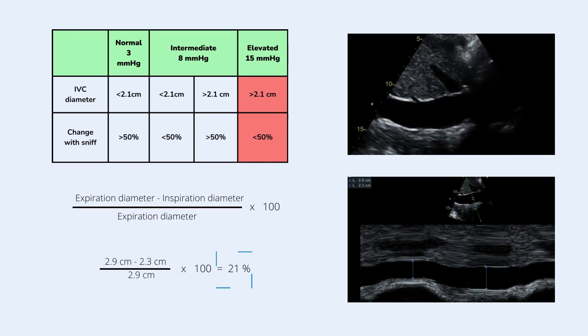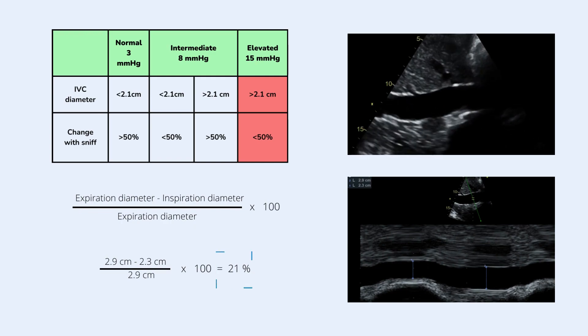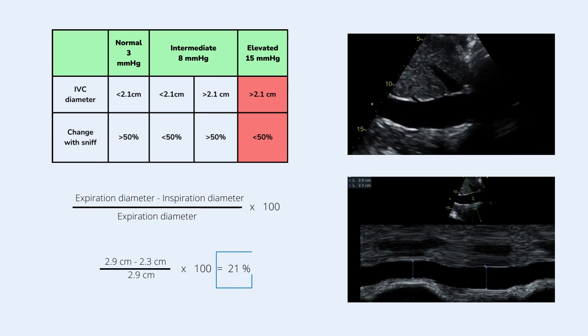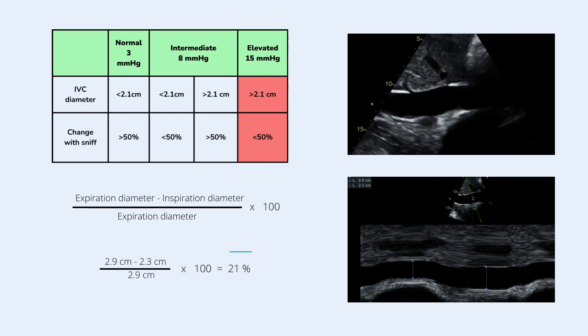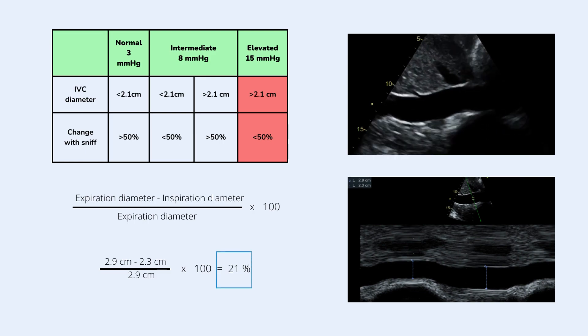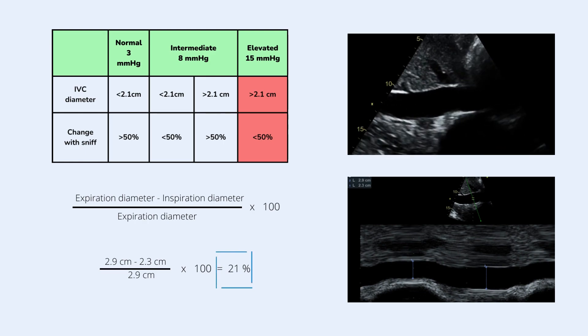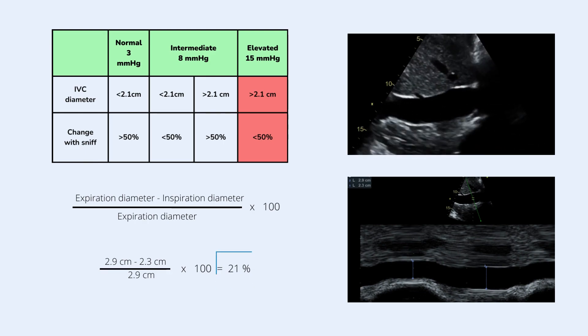An expiration diameter of 2.9 cm and inspiratory collapse of 21% would fall on estimated RA pressure of 15 mmHg. Therefore this patient has an elevated RA pressure.